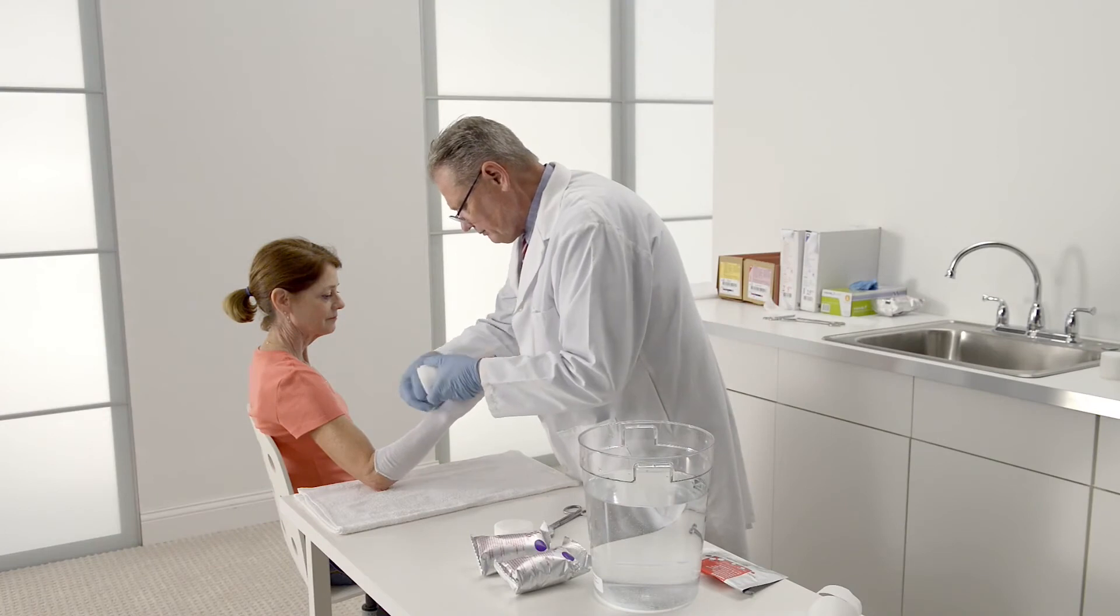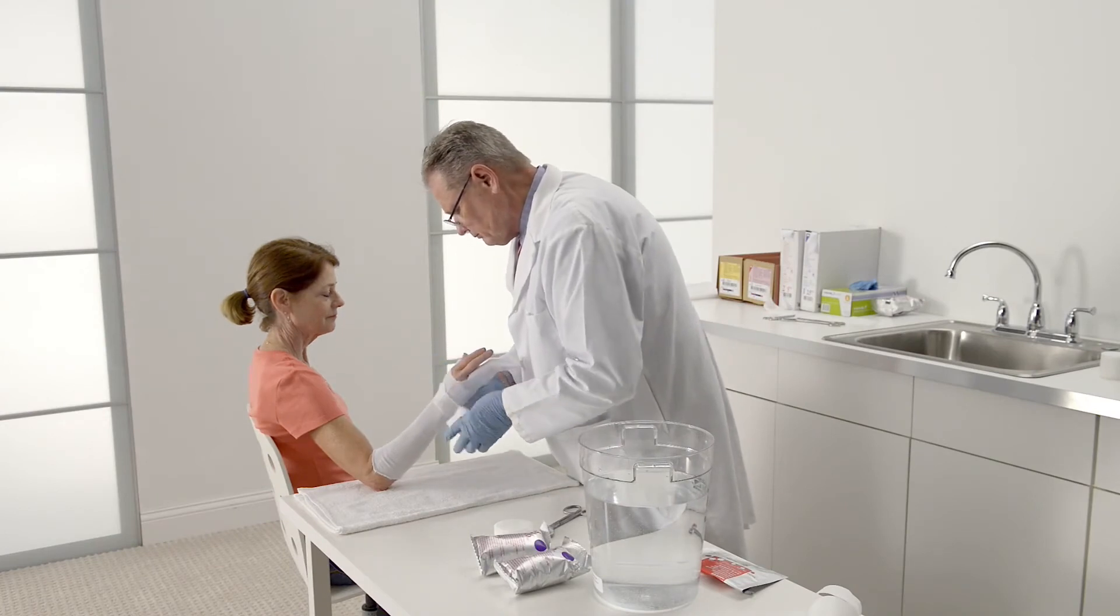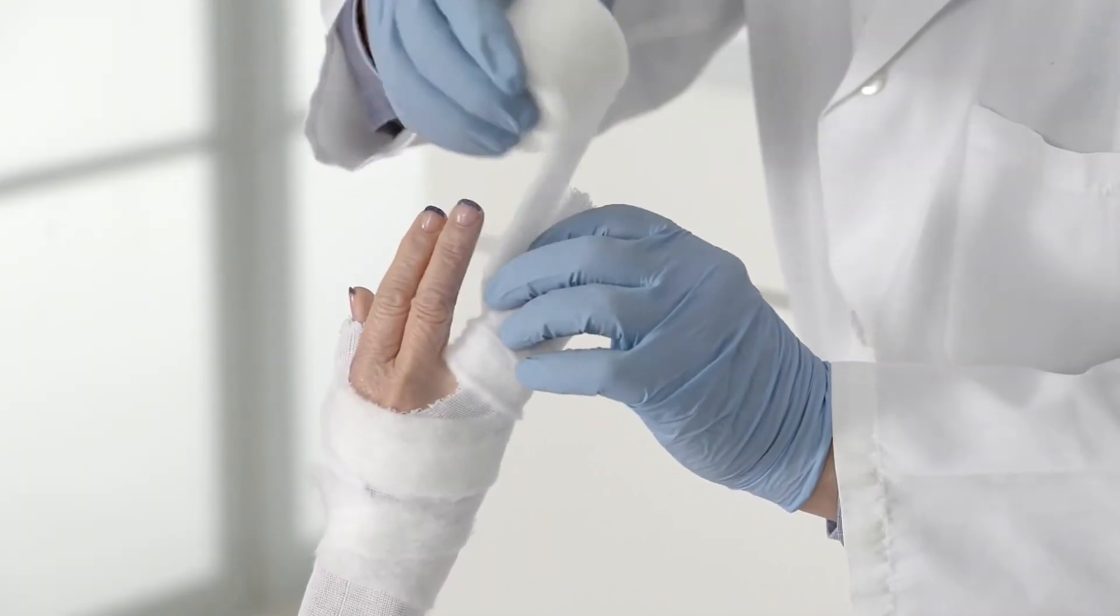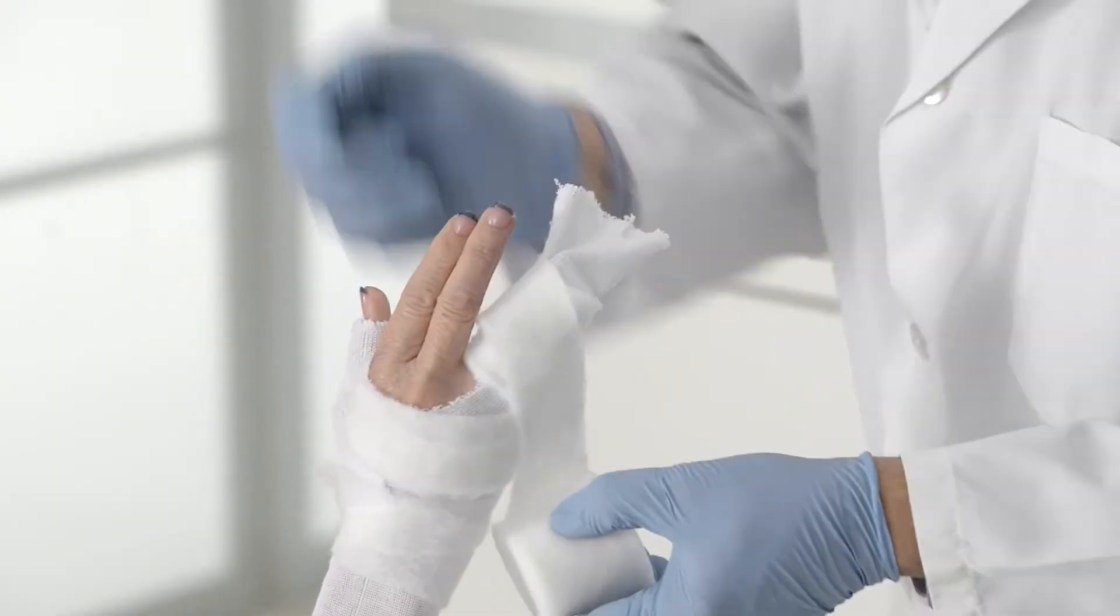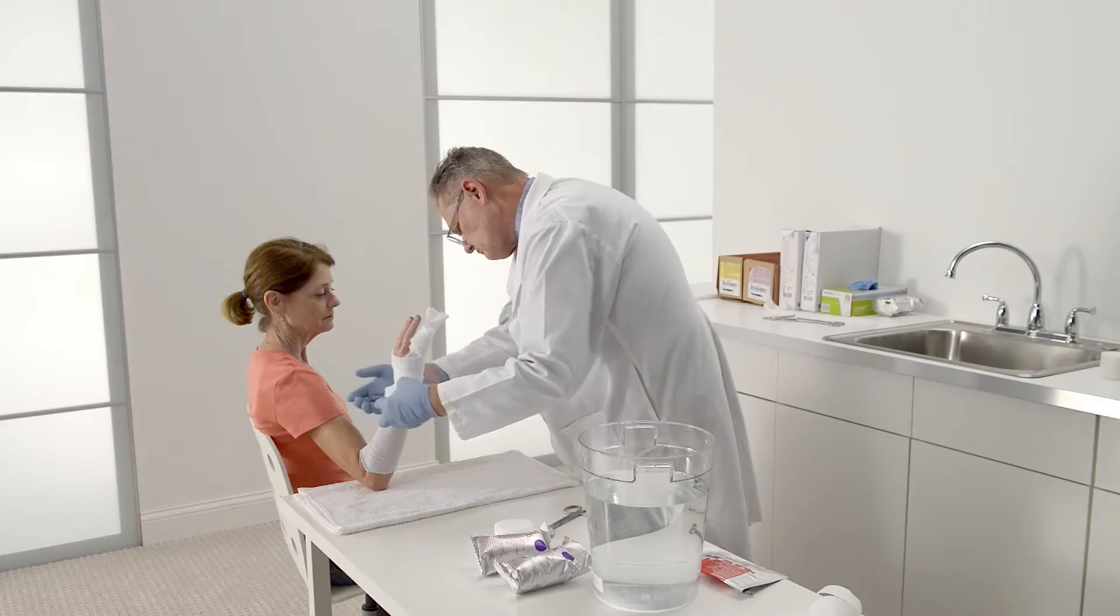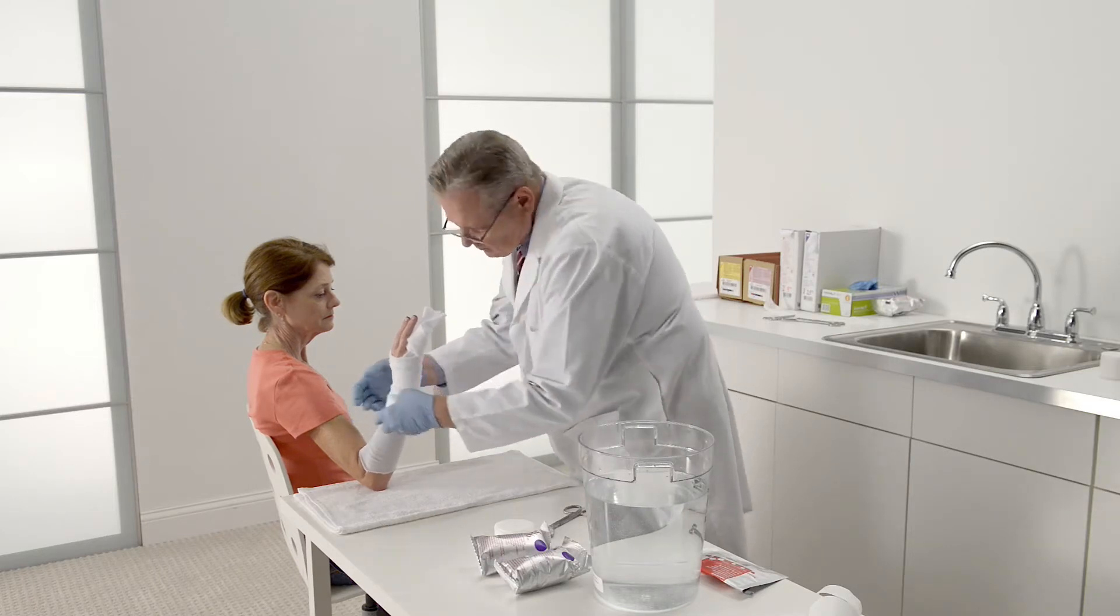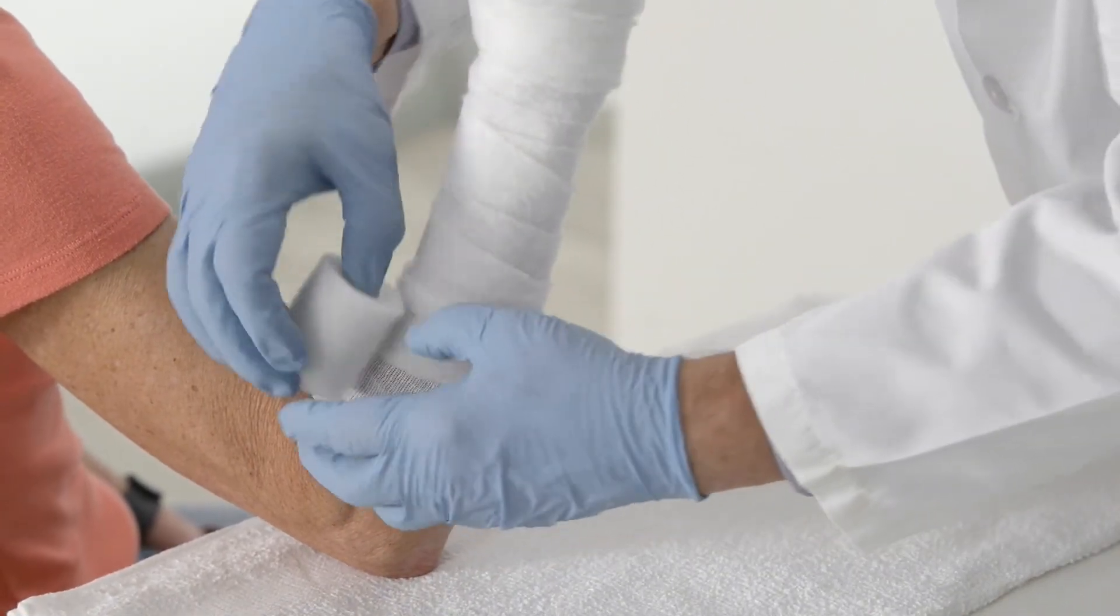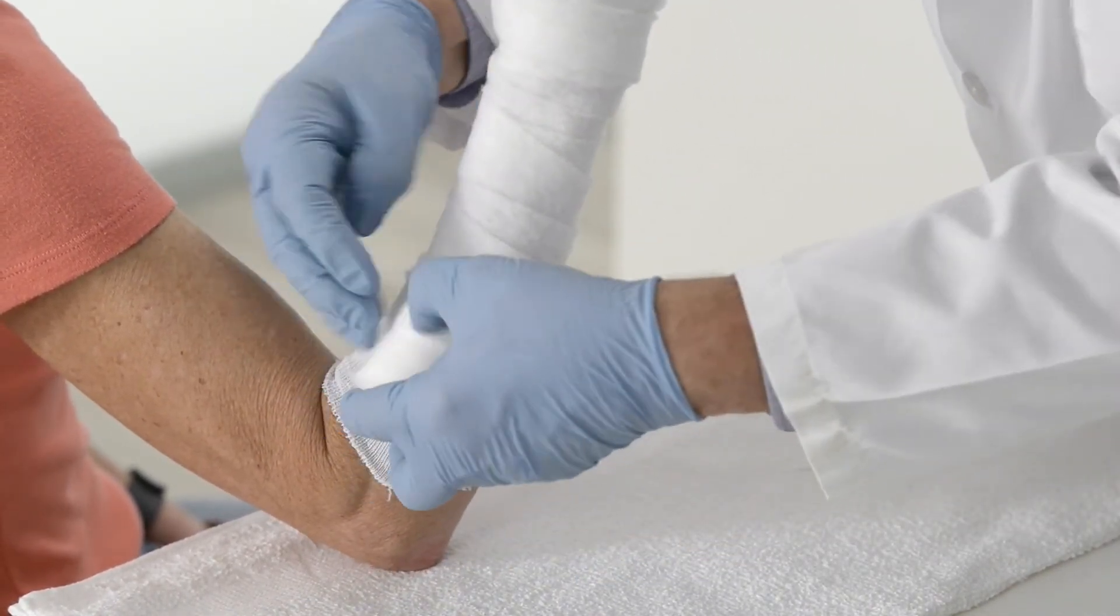Now it's time to apply the padding. Using 3M synthetic cast padding, begin at the wrist, then wrap around the fingers. Then wrap proximally, overlapping each preceding layer by 50%. Continue wrapping, stopping two finger widths below the forearm crease.